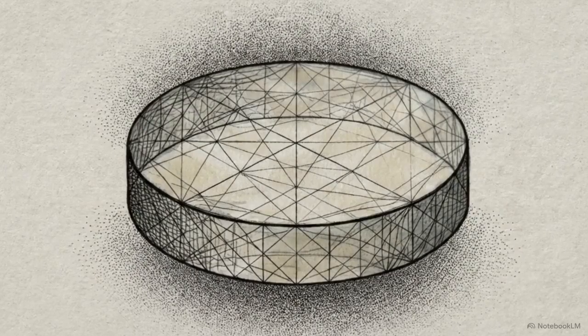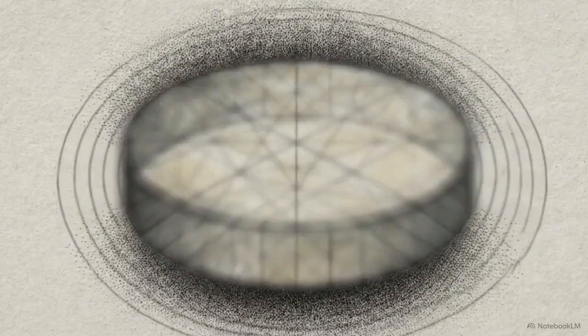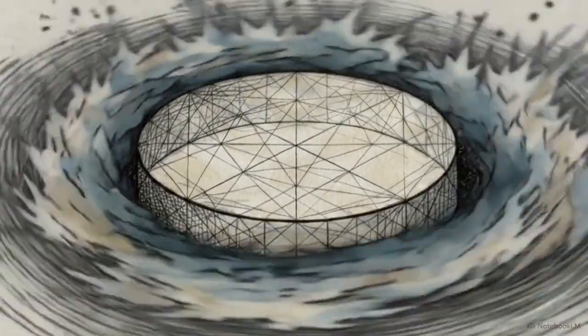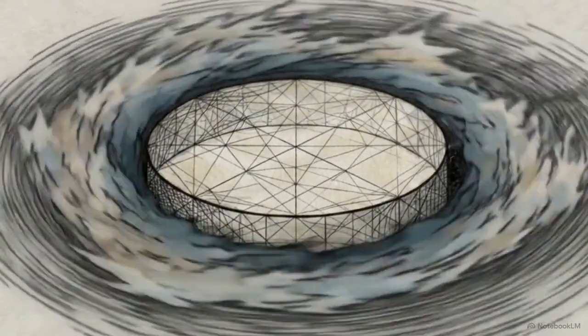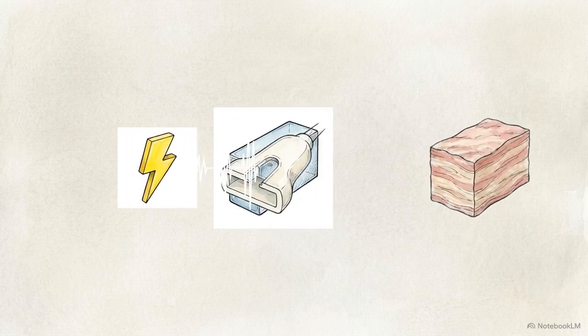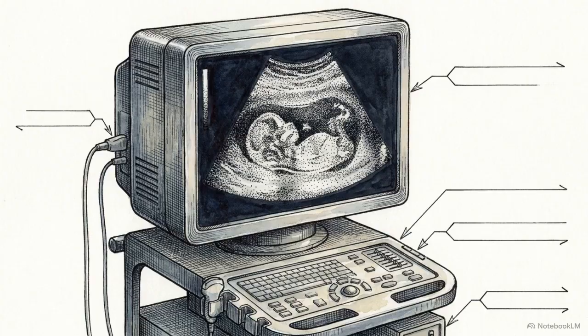Every ultrasound probe faces a specific physical task. It must project high-frequency sound waves into the body while simultaneously listening for microscopic echoes returning. B-mode imaging functions by converting acoustic pressure into electrical data. Returning echoes generate measurable voltages, which the system displays as points of brightness on a monitor.